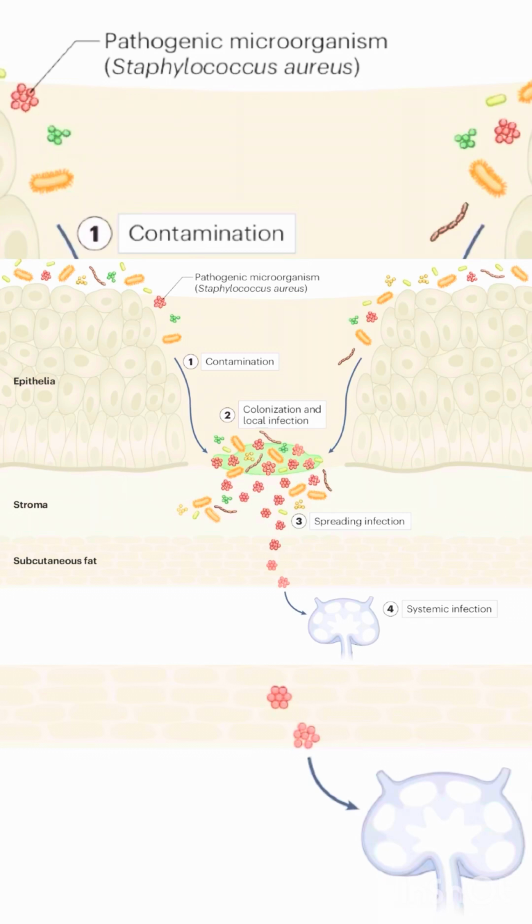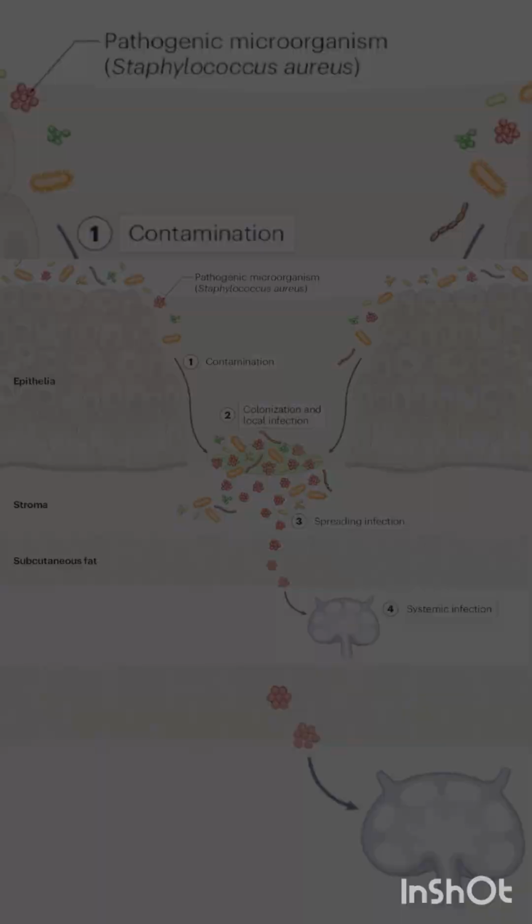And even though there may be contamination in the wound already, before we try to clean around the wound, we will prevent more contamination by cleaning the area before we take a sample. When the specimen is being collected, we have to ensure that the area or the site is prepped or cleaned before anything is collected. So when we're talking about bone or bone marrow collection, this is typically done in an operating room where it is sterile.